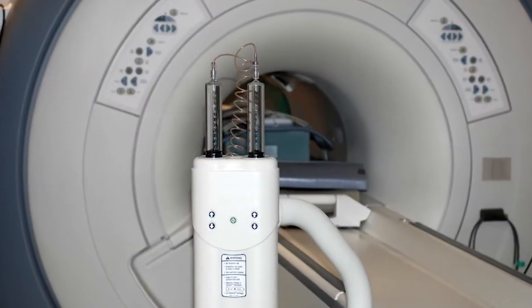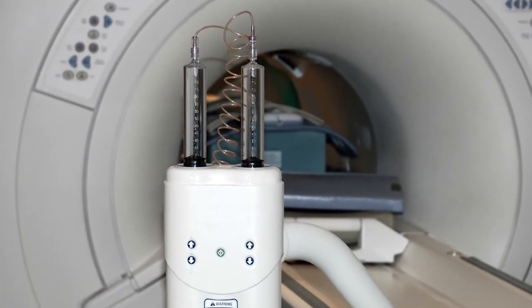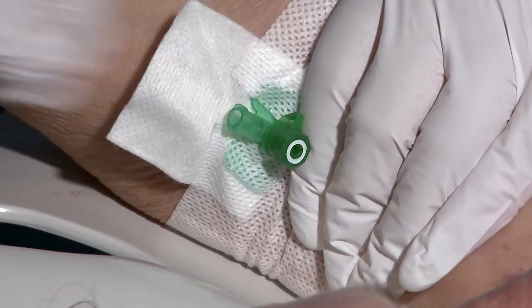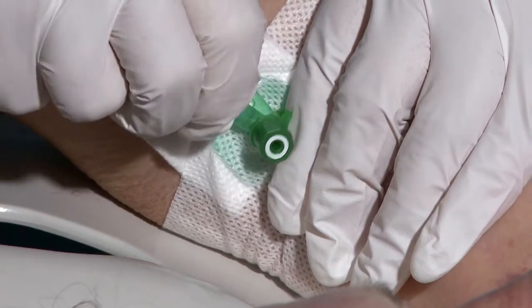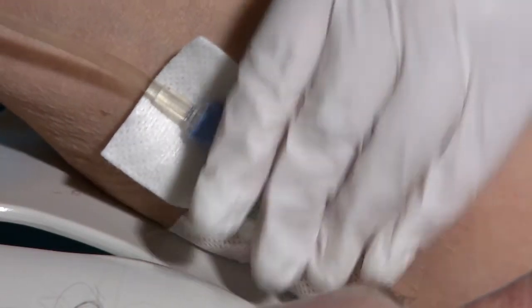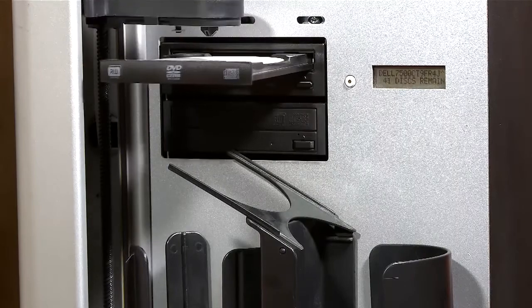For some examinations, a contrast agent must be administered intravenously using an automatic syringe injector. In the case of an examination requiring a contrast agent, the patient must refrain from eating for at least a few hours before the procedure. They must also present valid results of a creatinine test. All the images from the magnetic resonance examination are transferred to a CD.